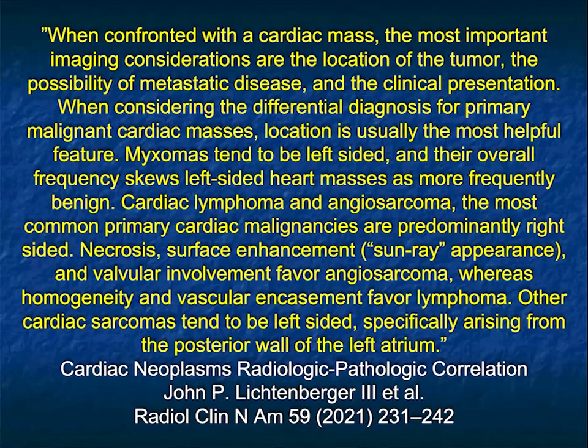Now, summarizing then, we've covered a lot of material in these two lectures. We've looked at a range of cardiac tumors. We've looked at some of the specific findings in the cardiac tumors. We spoke about things to think about from location, like myxomas are left-sided, and lesions off the valve are typically fibroelastomas. When they involve the right atrium, it's typically angiosarcomas. And when it's more extensive and diffuse, we're thinking about lymphoma.